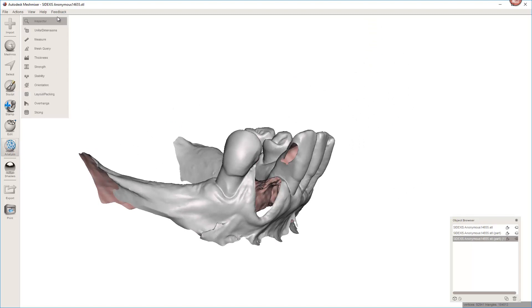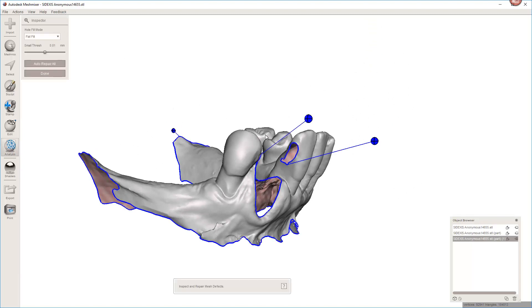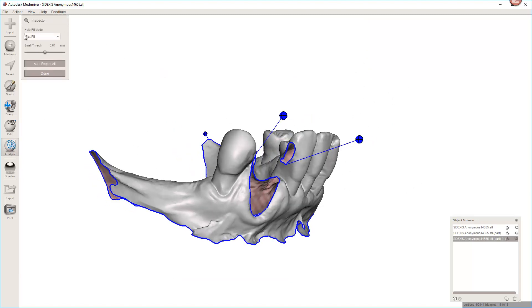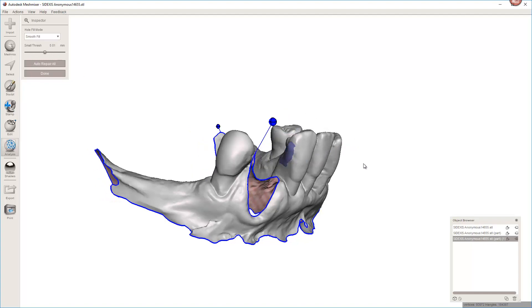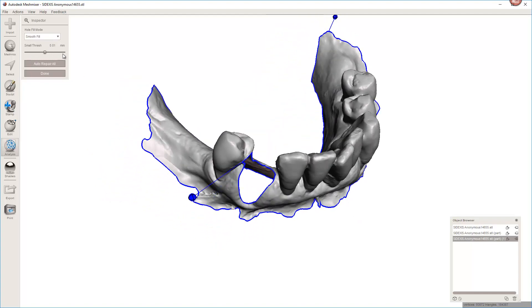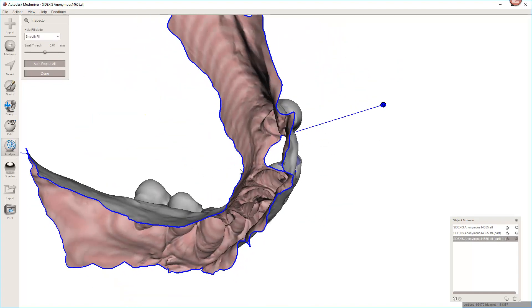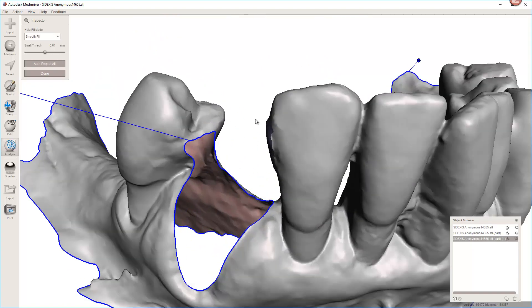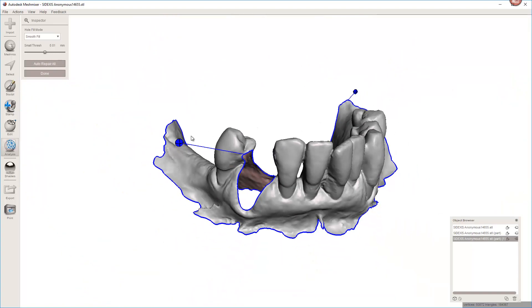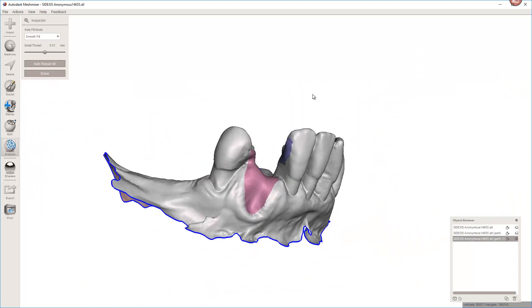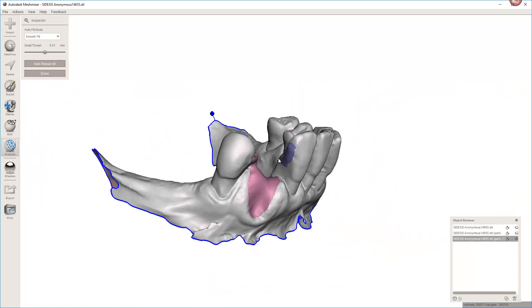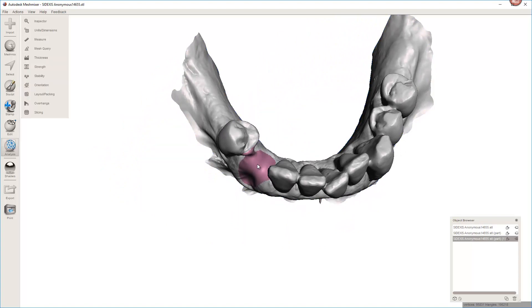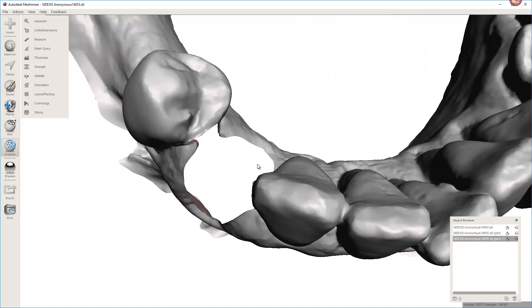So I've got two little cut out areas. I'm going to go to analysis, inspector. And this one's pretty simple. I'm going to make sure that it's on smooth fill. And click right here. We don't want to do all of them because I do not want it to fill the base. That's a nightmare. It just sits there forever. Now, you could just click here and then you'll get sort of a wonky little connection here.